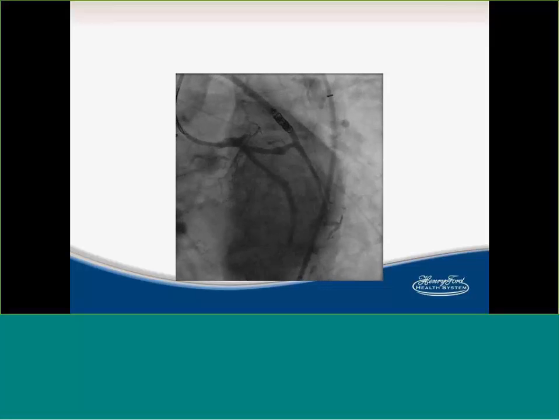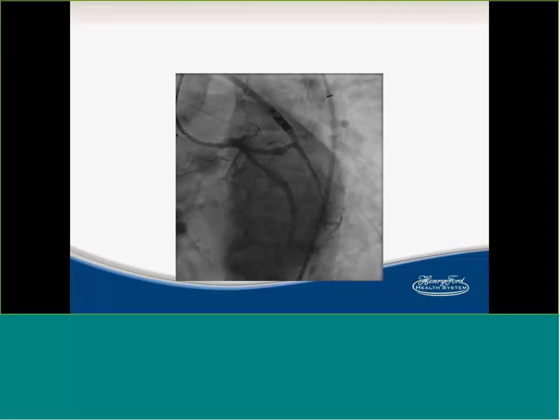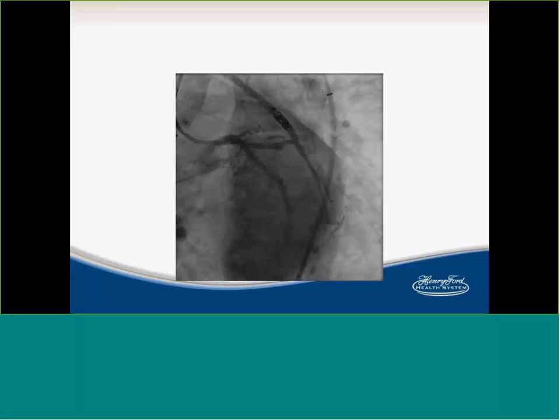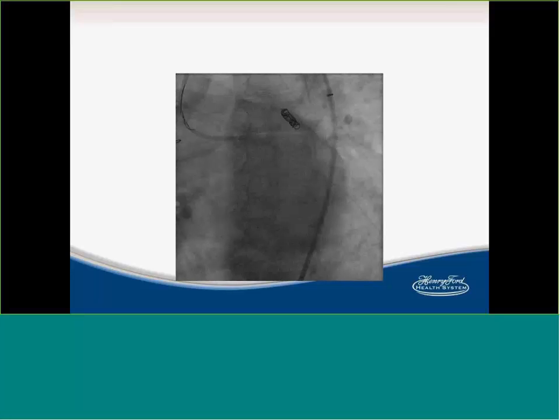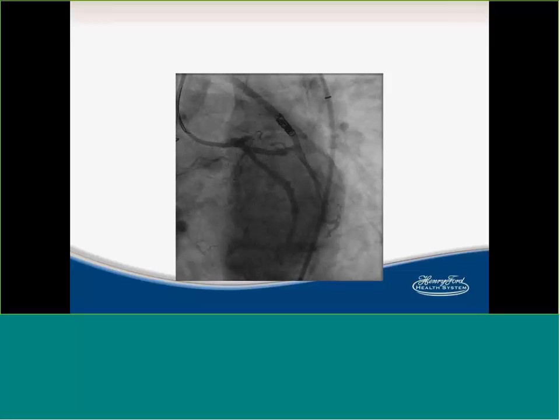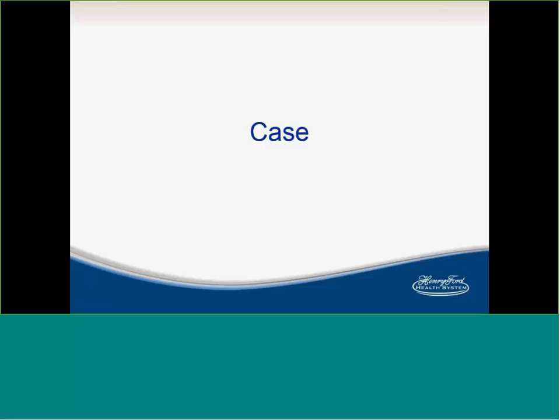Perfect, and I think you're absolutely right. Sometimes you have so much scar tissue down in that anastomosis area that your wires may not go through, whereas it's much easier to do that retrograde. So again, that's something very unique. For the audience, this is not something you do every day. This is for very experienced operators, a last resort technique to cross these balloon uncrossable lesions and get success.